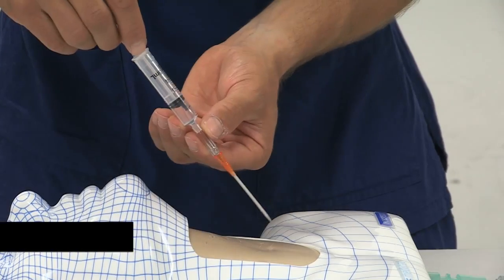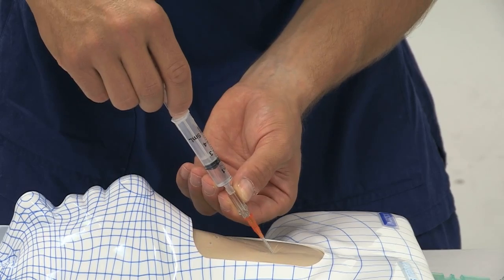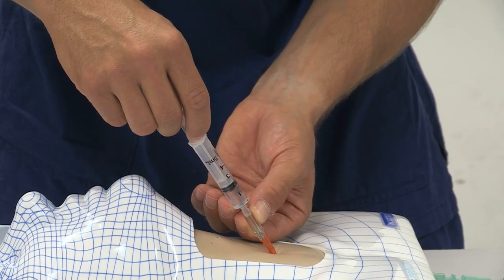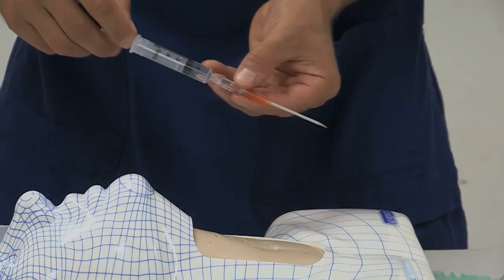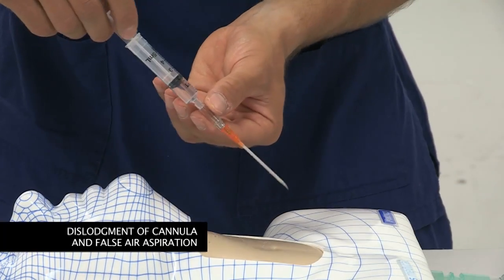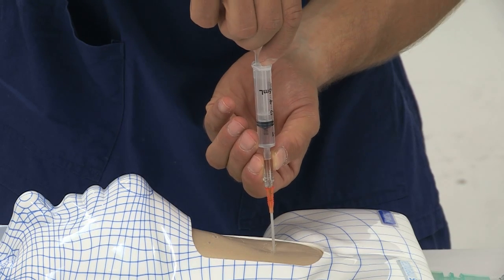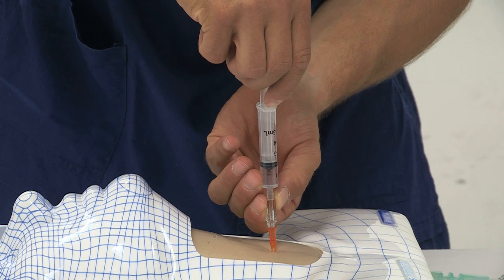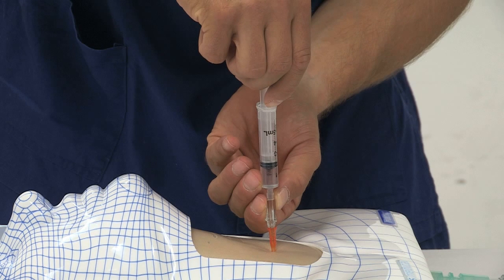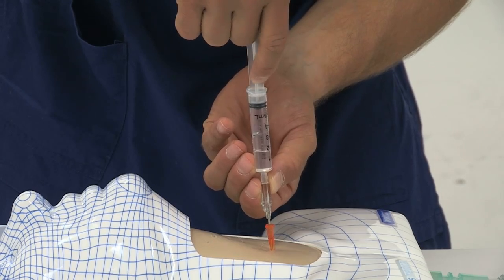If it is not possible to palpate airway anatomy, a too shallow angle of insertion of the cannula can result in failure to reach the airway and failure of the cannula technique. After a failed cannula insertion attempt, the assembly of trocar and cannula should be removed while holding the cannula hub onto the trocar. Failure to do so may cause dislodgement of the cannula from the trocar and false positive air aspiration.